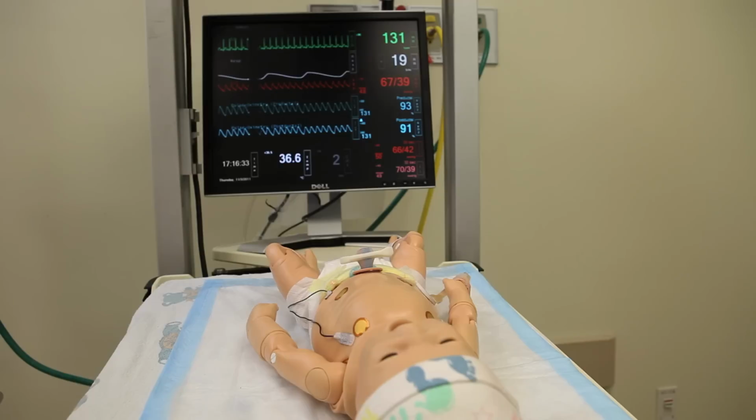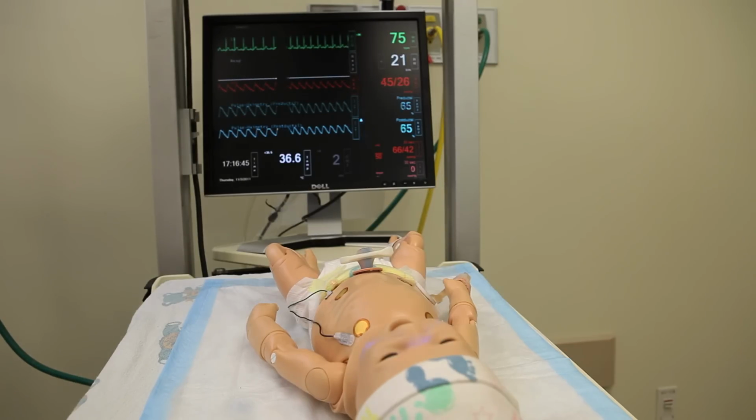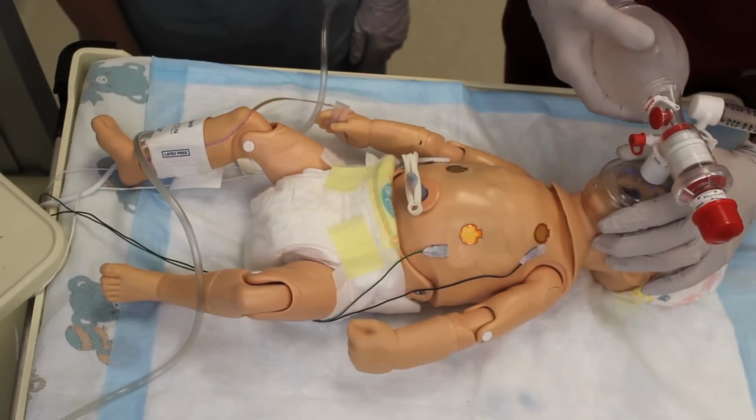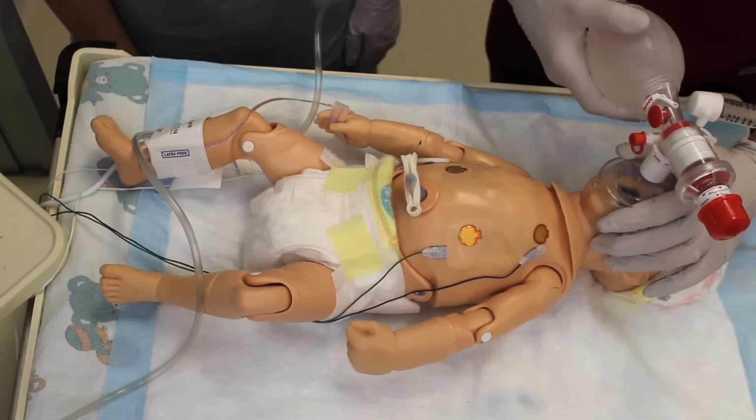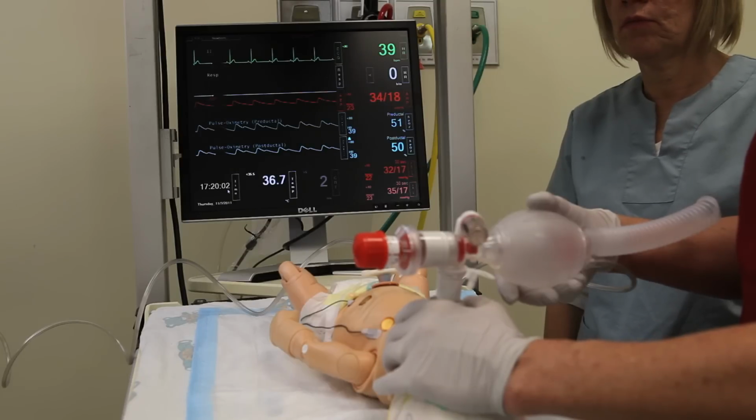We're going to see that the heart rate is going to decline now in this part of the orientation, and the baby will end up at a point where we need to do CPR. We're going to demonstrate for you how to do the CPR on this mannequin. We can see here that the baby's apneic and bradycardic, and the respiratory rate is reading 0.